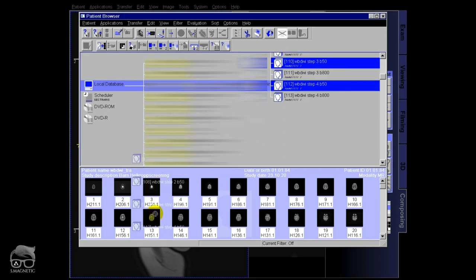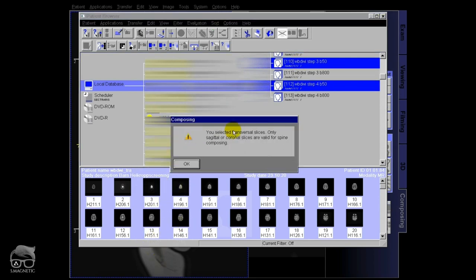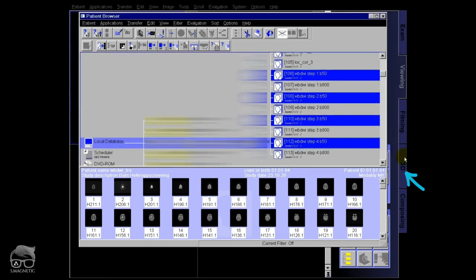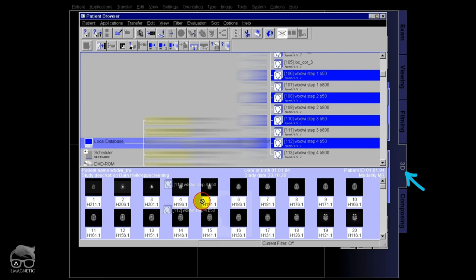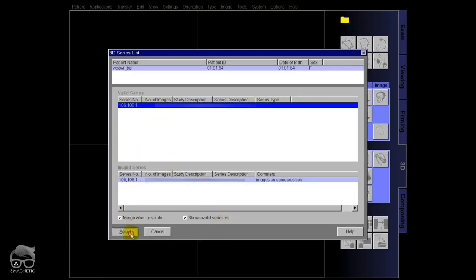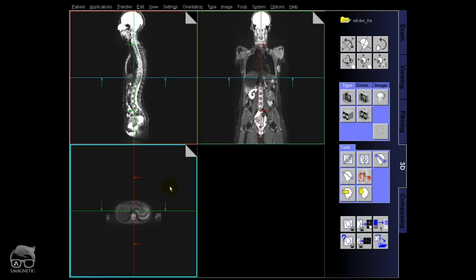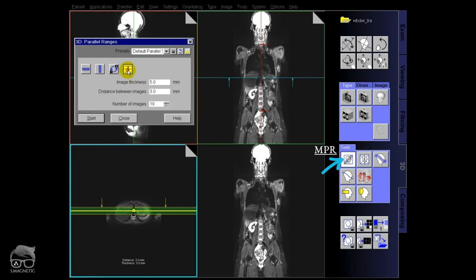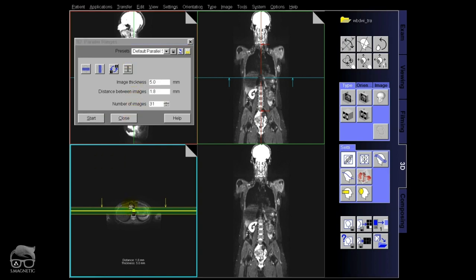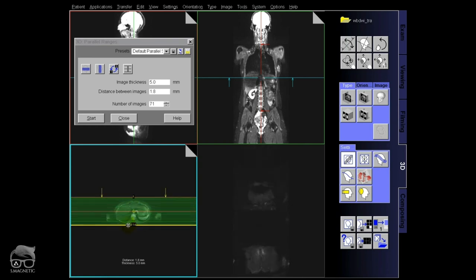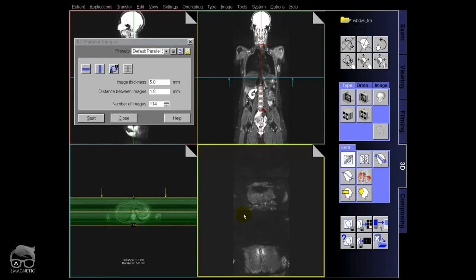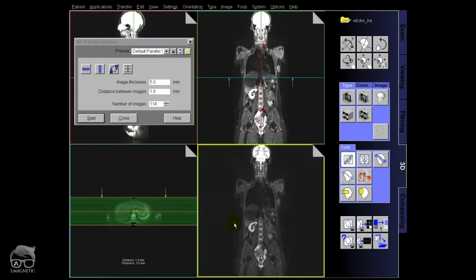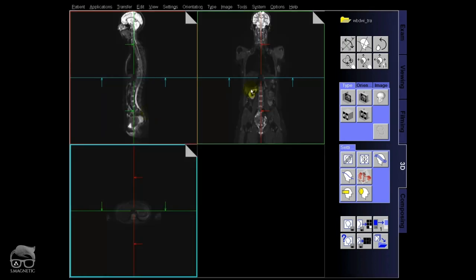If you go into composing now you still get the same error message because it's transversal. So what you can do now is go directly to the 3D mode — drag and drop — and it works! You can do the post processing here: MPR or MIP, whatever you or your radiologist wants. You can view in all planes, and you can start and save. This is b50. You can also do the sagittal plane and whatever you want.